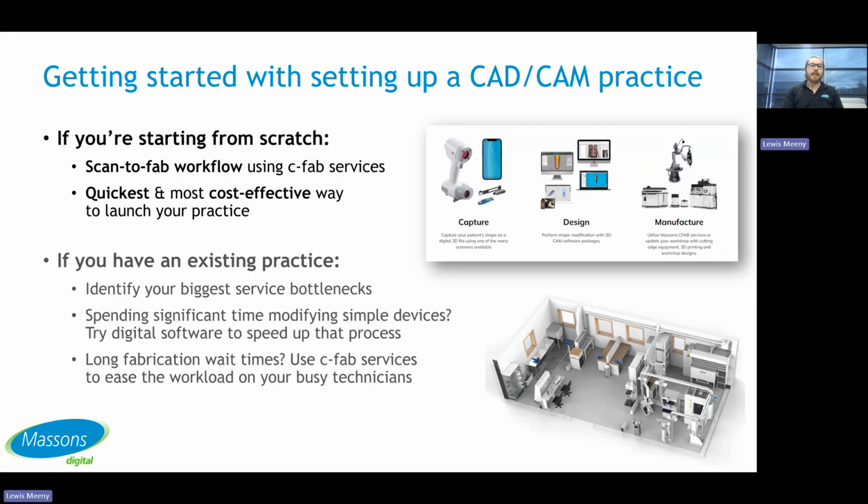If you have an existing practice though, and you're looking to integrate some CAD/CAM, I'd suggest identifying your biggest service bottleneck. So wherever it is that things are backing up, that can be the best place to start looking at where CAD/CAM integrates. Like if you're spending a lot of time modifying simple devices, are you doing the same AFO mods or the same prosthetic mods over and over again? You can basically do them with your eyes closed. Well, maybe try leveraging some digital software to make that process even faster.